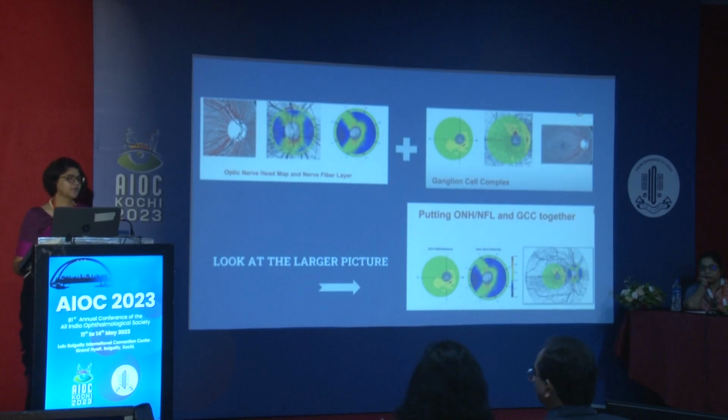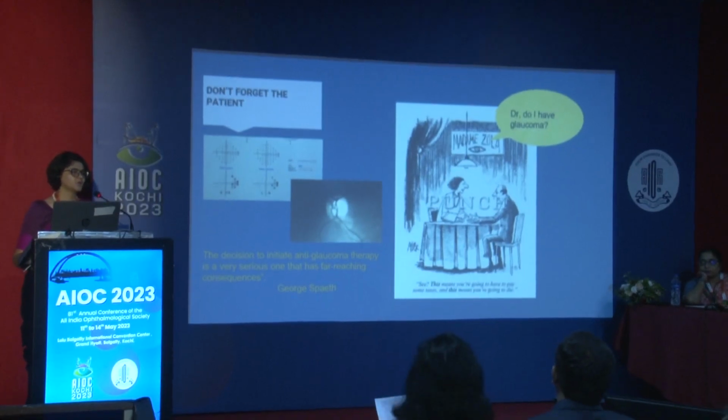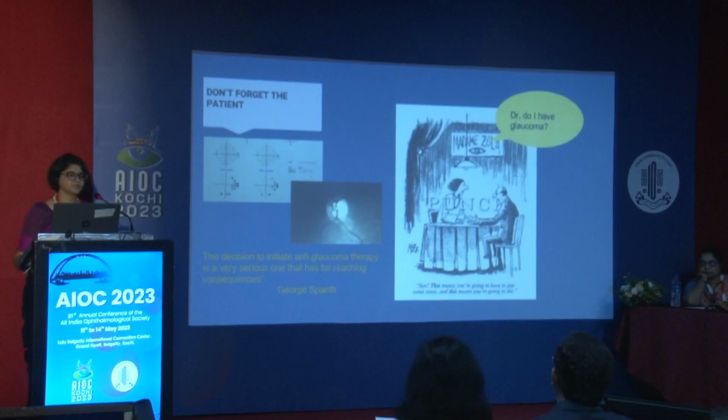Always a good idea to look at the larger picture, both in the OCT aspect as well as the patient as a whole, see the whole clinical picture. Never look just at the OCT and make your diagnosis or treatment.